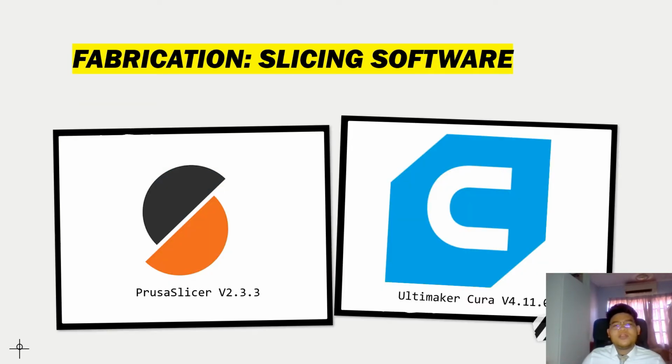For the slicing software, I've chosen 2, which are PrusaSlicer and Ultimaker Cura. Why do I choose these 2? Because these 2 have some features that the other one doesn't have. For example, in the slicer I can set where I want the layer to pause, compared to Ultimaker Cura, where it is much harder to do so.